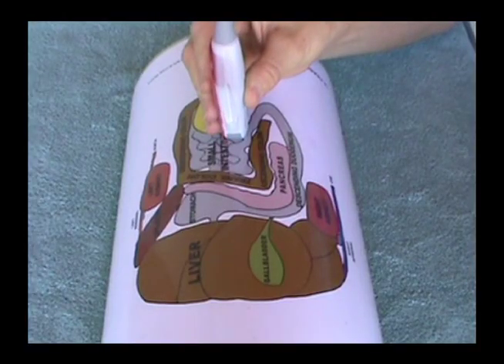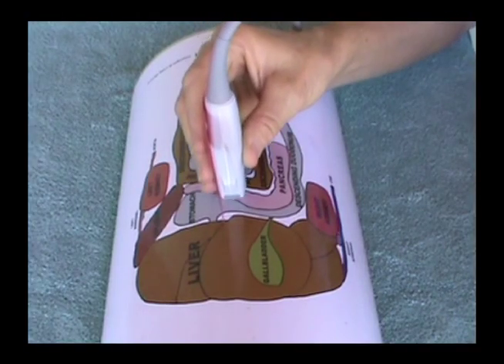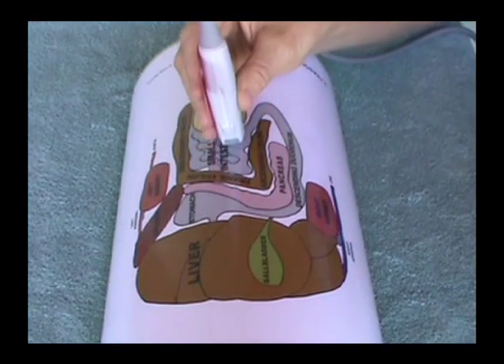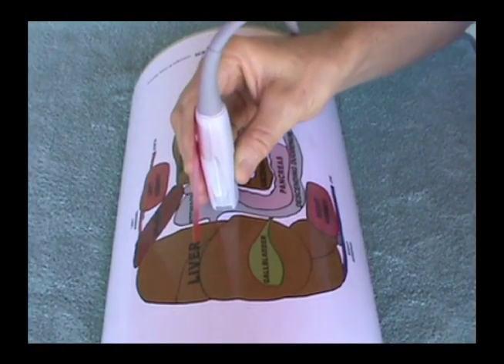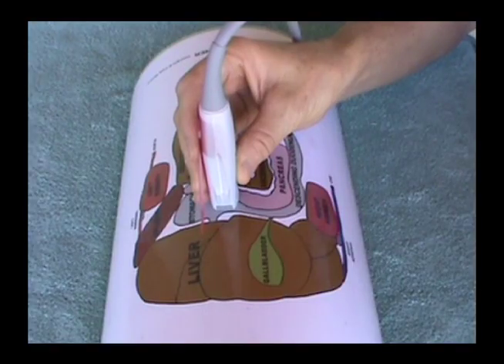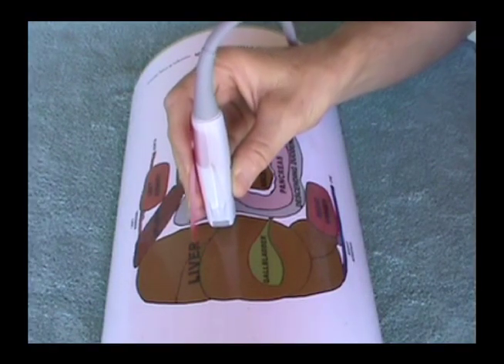The sagittal plane is any longitudinal or long axis plane of the patient's body stretching from the patient's head to the tail. Use the abdominal graphic included with this DVD to copy my movements. In abdominal ultrasound, use the ventral midline sagittal plane to view organs like the liver.